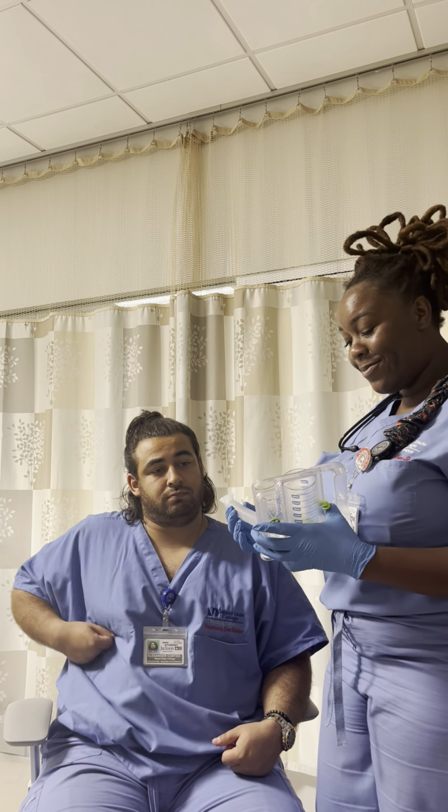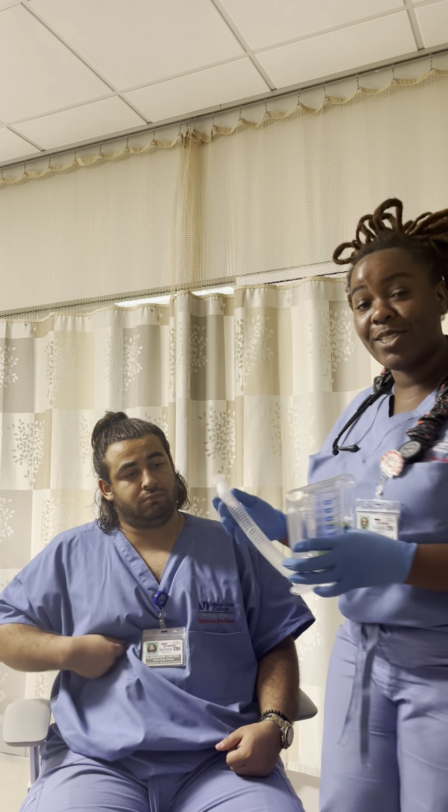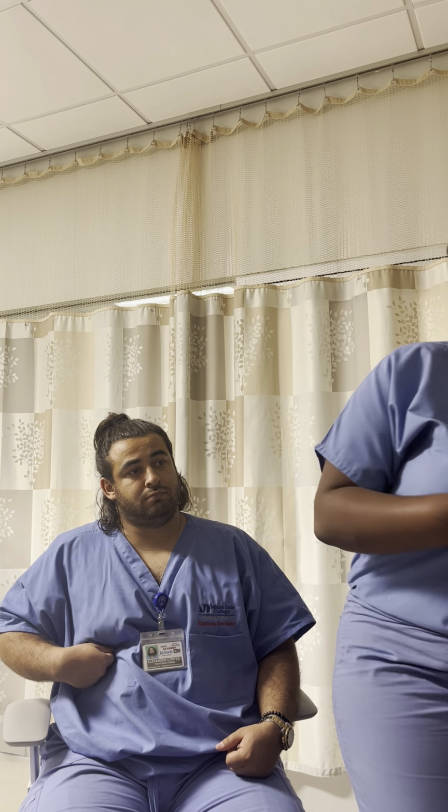Okay, and so before we begin, we're going to do the vitals.